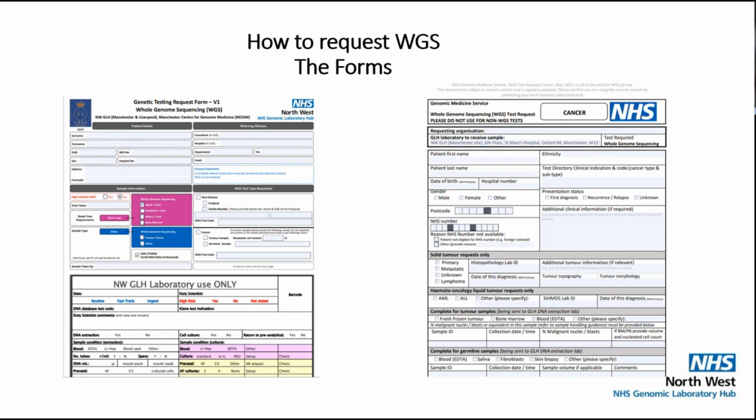This is actually done in two centres. So the material is sent to us for extraction. We send that material away to a large national sequencing centre. They do the sequencing and the analysis. Initial bioinformatic analysis is done by a national provider, by Genomics England, and then that data is returned to us for that final scientific analysis and interpretation.